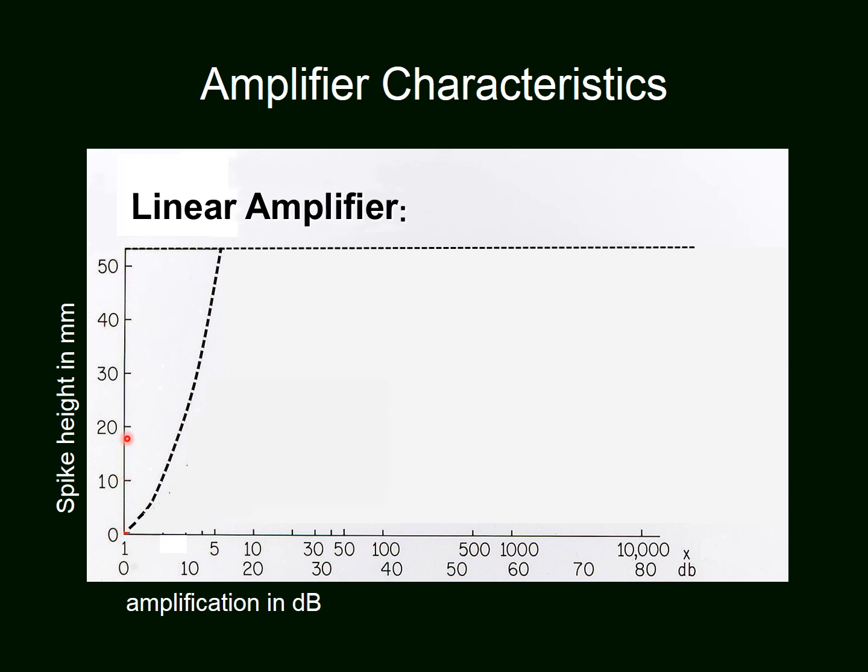Vertically we see the height of the spikes in millimeters as the result from the amplification in decibels.